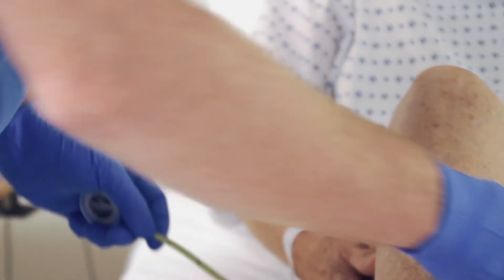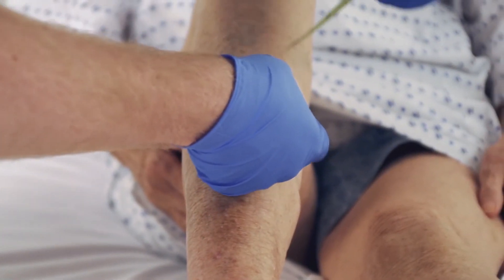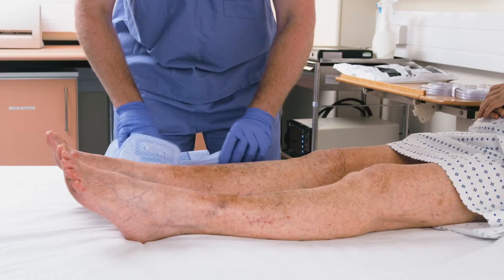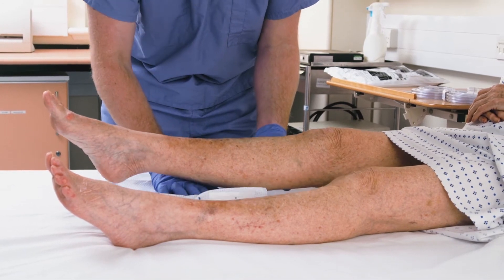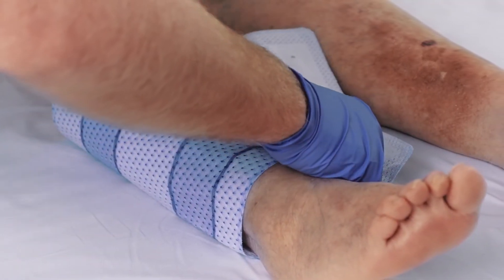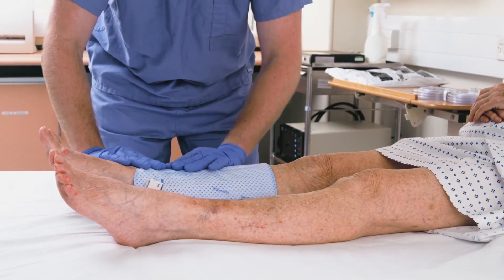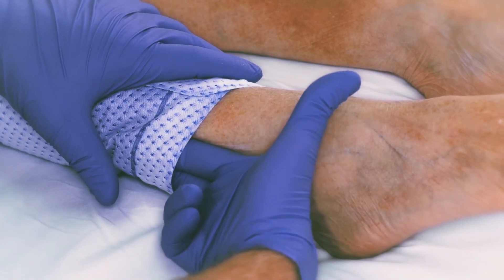For knee length sleeves, measure the circumference of the patient's calf at the widest part, then refer to the Kendall SCD system sizing chart to determine the correct sleeve size. To place the knee length sleeve, orientate it with the back of the patient's leg, then wrap the sleeve around the leg, fastening the Velcro closure tabs. Make sure to leave approximately two fingers of space between the deflated sleeve and the patient's leg.